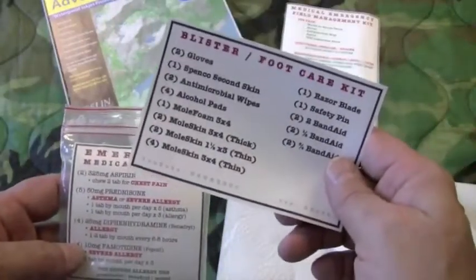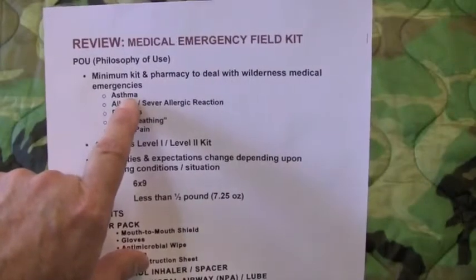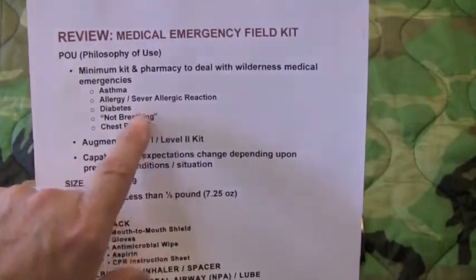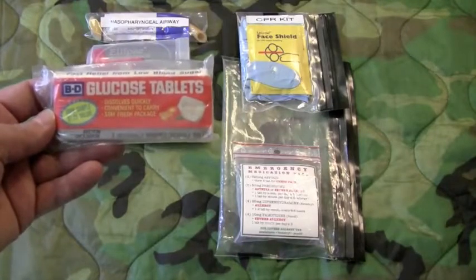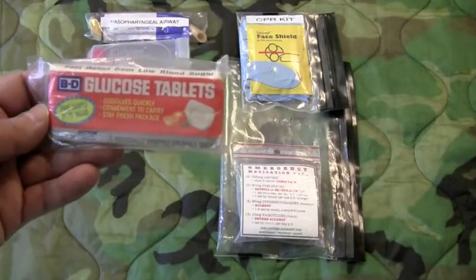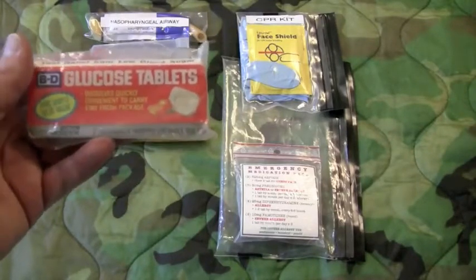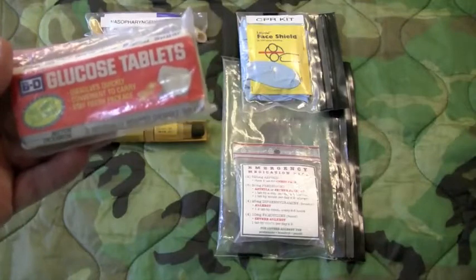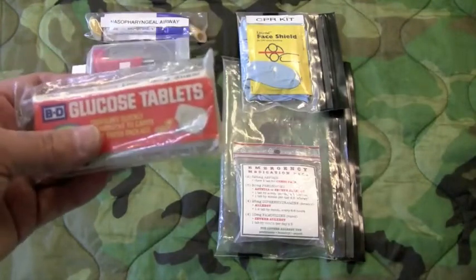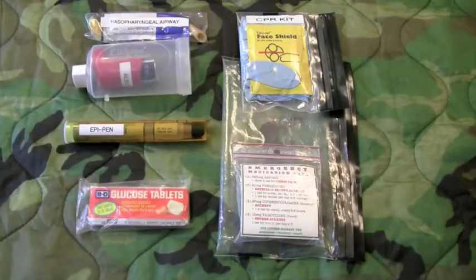Let's go over the medical emergencies this kit is designed to handle — to recap: asthma, allergic reaction or severe allergic reaction, low blood sugar, not breathing, and chest pain. If you have a person in your group with diabetes and there's reason to think their blood sugar is too low, this is how you manage it. These glucose tablets — this pack has three of them — you only use for a patient who is awake and can put something in their mouth. One to three of these in their mouth, let them dissolve, and this will get their sugar back up to a normal level.